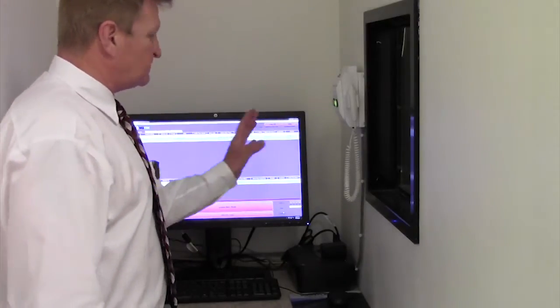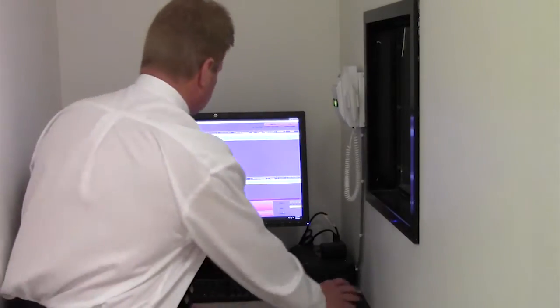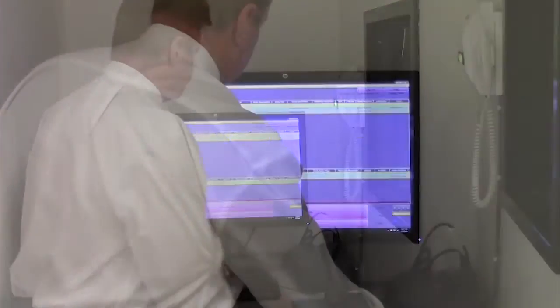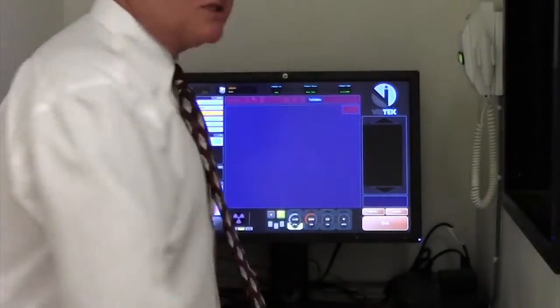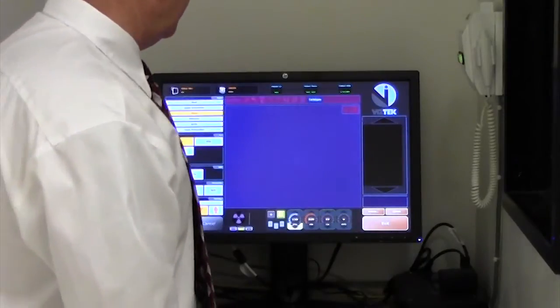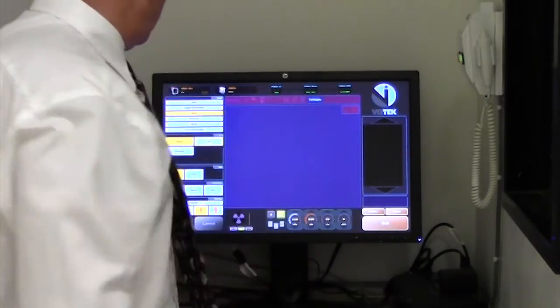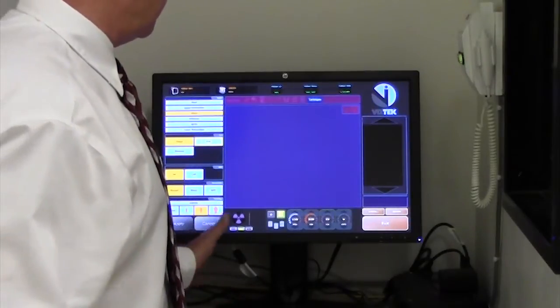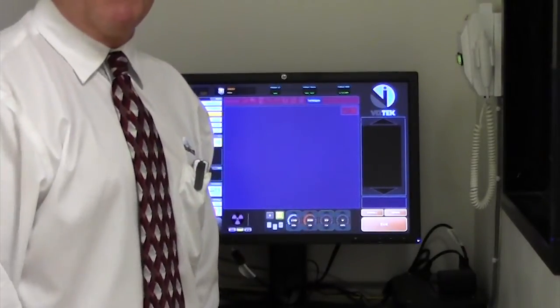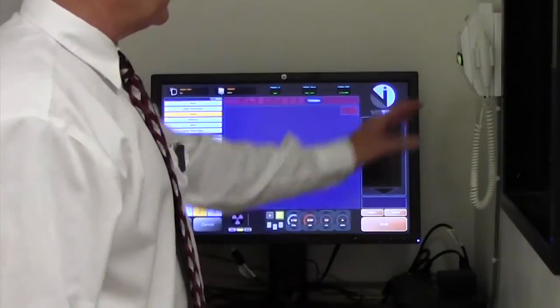The software drives and controls the operator's console. To acquire an image, you basically input the patient's ID number, name, date of birth, select the procedure, and the acquisition screen appears. Once you pick the procedure, the patient size, the anatomical program controls the exposure factors.